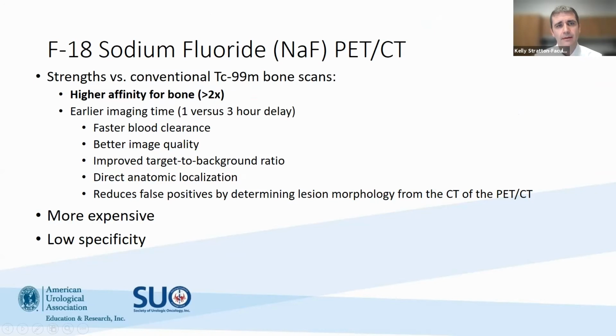So sodium fluoride PET was listed as the first option in those next generation imaging lists. It's a bone targeted PET imaging modality. It has higher affinity for bone lesions, so it improves the image quality, but it's very much similar to nuclear medicine bone scans. And so sodium fluoride PET, while it was approved, it's not paid for by Medicare. And so it really hasn't been widely adopted since that reimbursement issue has occurred.